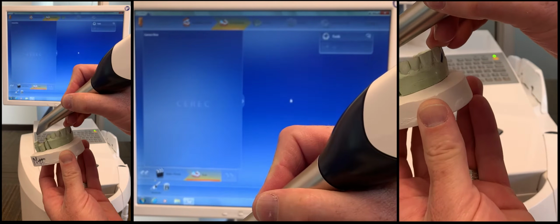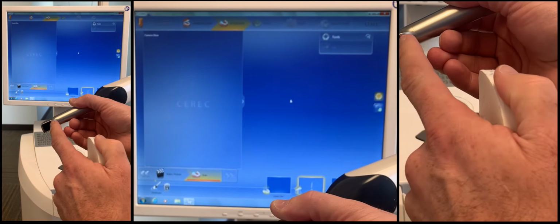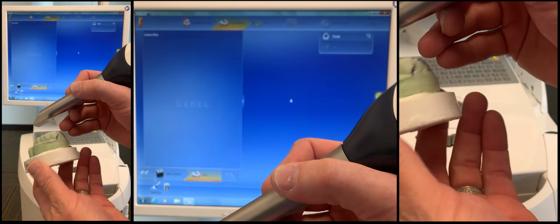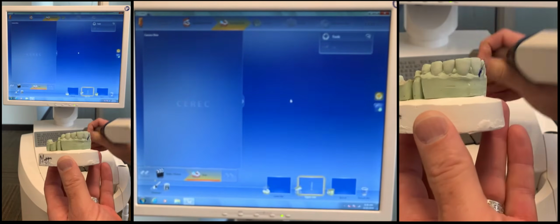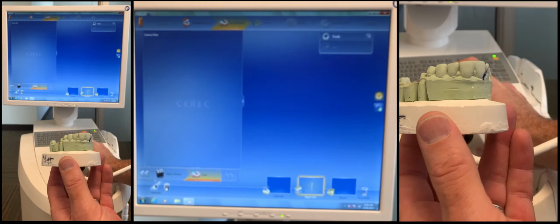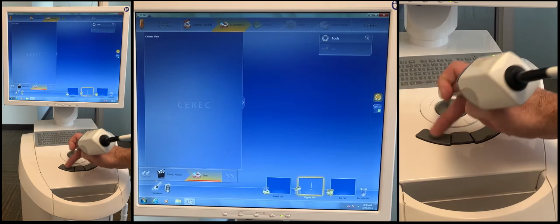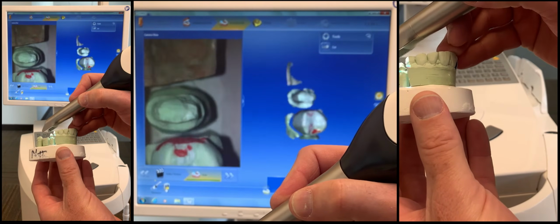And then, like I mentioned a minute ago, we're going to want to avoid dragging the lens over the teeth, because that'll scratch the lens and put those little scratch marks that you saw. But the idea is, as soon as you get the appropriate focal length, it's going to start capturing images. So let's demonstrate that. I'm going to turn on the camera. Just going to mouse over the camera switch. I'm going to left click there, and I'm going to bring it down into focal depth.